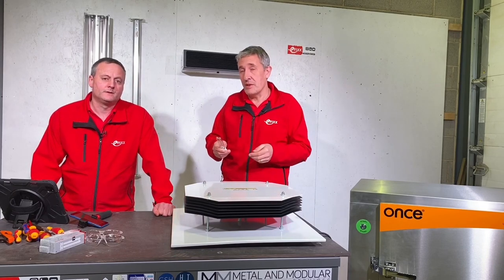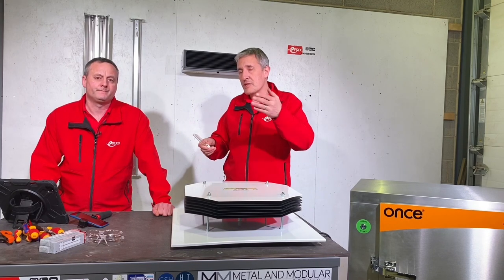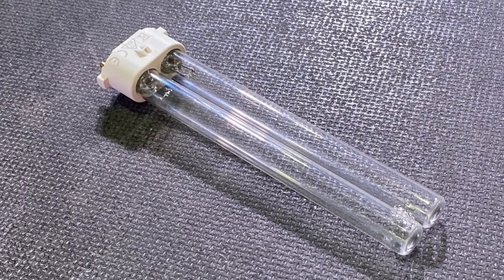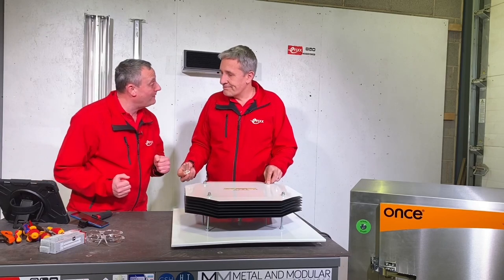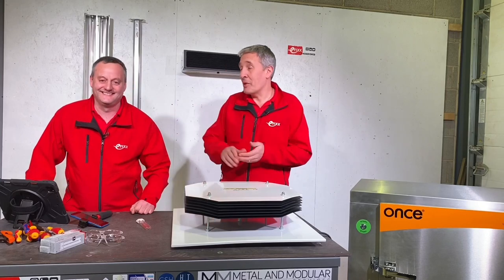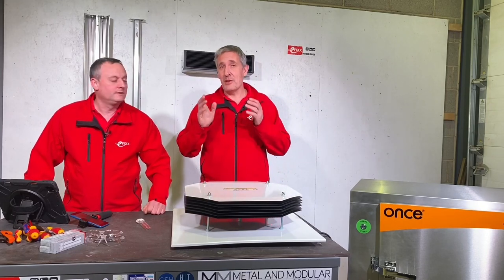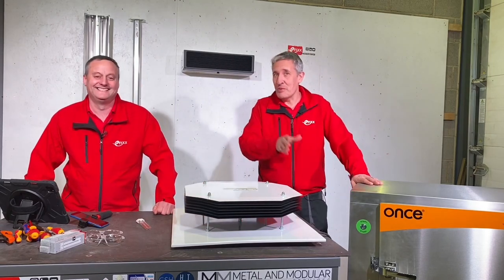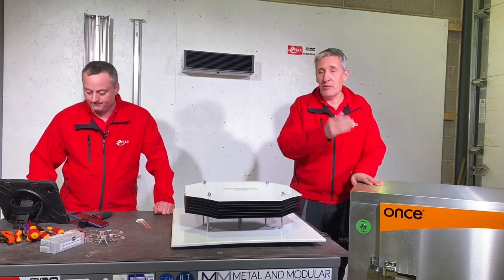UVC disinfection is not a new technology — it's been used in water treatment and many industrial applications, but in current times it finds new applications. These UVC lamps will inactivate bacteria and viruses, and we know how hot a topic viruses are right now. Think of it as the lighting industry's equivalent of Domestos, but with the obvious advantages of not requiring chemicals.